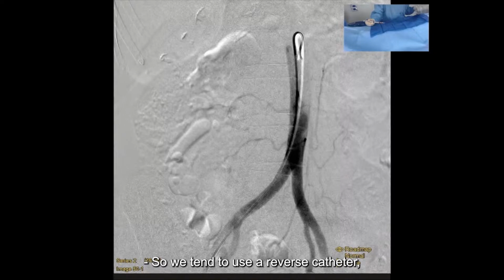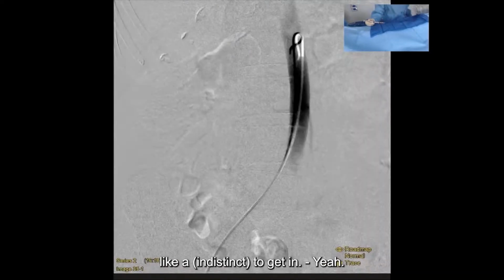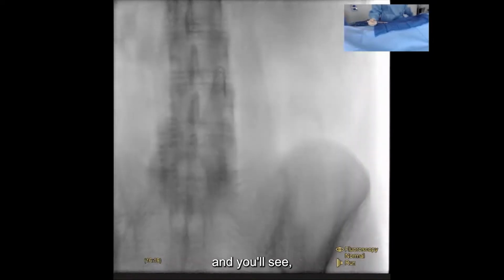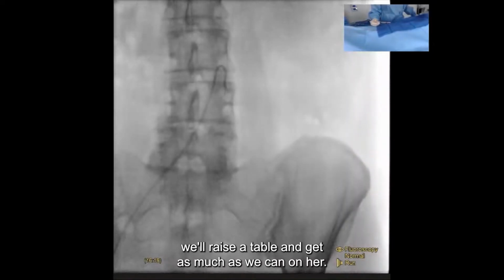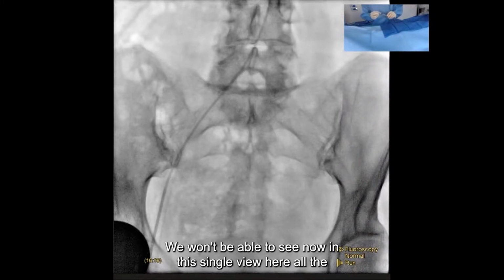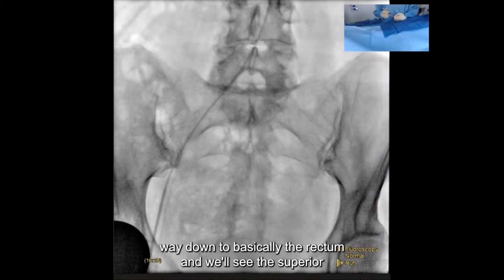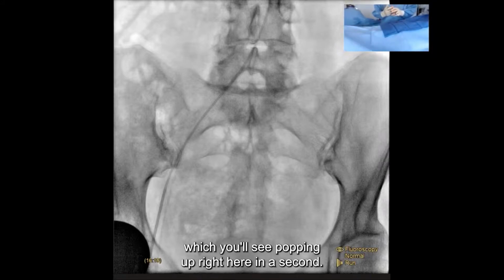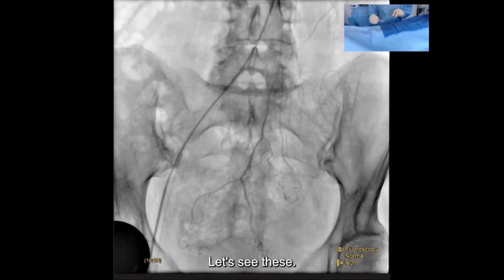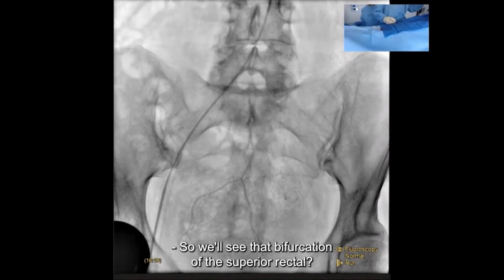So we tend to use a reverse curve catheter, like a SOS, to get in. Yep. So once we get into there, then we'll go out of our RAO and just go to an AP view, and you'll see it. We'll raise the table and get as much as we can on her. We won't be able to see in this single view all the way down to basically the rectum. We'll see the superior rectal arteries on this run, which you'll see popping up right here in a second. Let's see these. Bifurcation of the superior rectal.